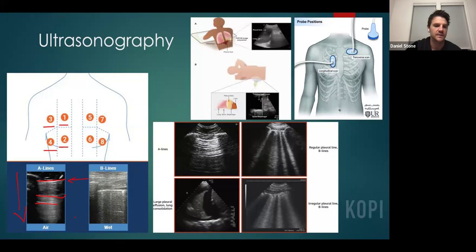And it creates basically like a folded representation of the actual pleura that it's evaluating in an equidistant plane. So you can tell that if you looked at it with the ultrasound machine, that the distance from here to here is the same as the distance from here to here. And then ultimately the distance from there to there is also a symmetric field, if you will.